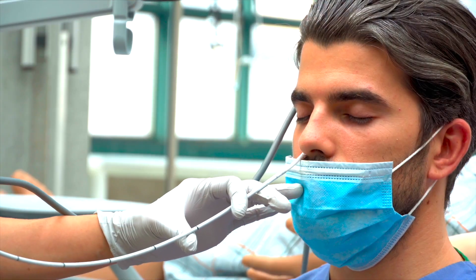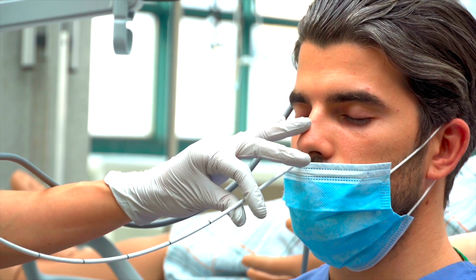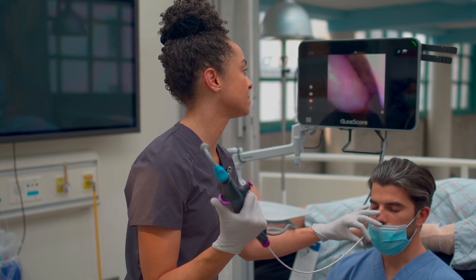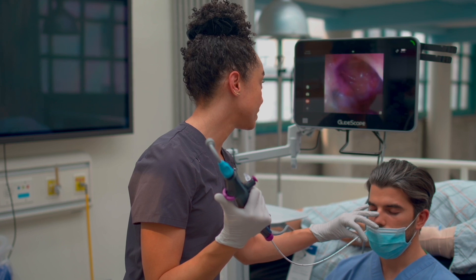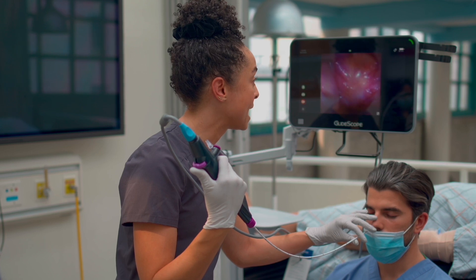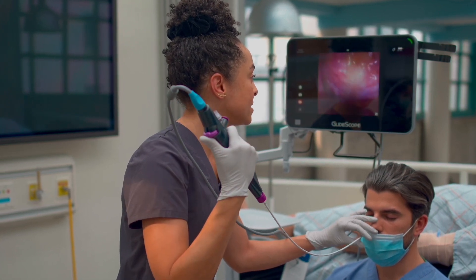I'm going to gently insert the scope into the nostril, then change my position — this is a personal preference. I'm heading towards that middle turbinate, trying not to touch the septum; the septum is exquisitely tender and sensitive to pain. On the left is the opening of the eustachian tube — you don't want to take that, it goes to the ear. Straight ahead is the adenoid pad. What I want to do is go down around the soft palate.